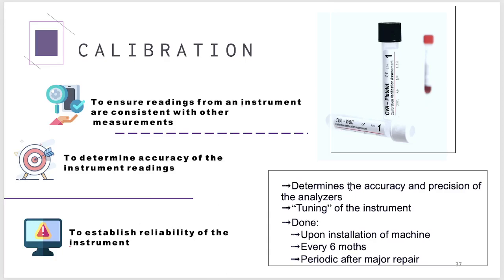So this will determine the accuracy and precision of the analyzers. Somehow this is tinatawag natin na tuning up of your instrument. So this is done upon installation of your machine and every 6 months. So pag calibration, every 6 months lang yan, pero yung mga QC, QA, that's every day. And there is a periodic calibration after certain major repair.